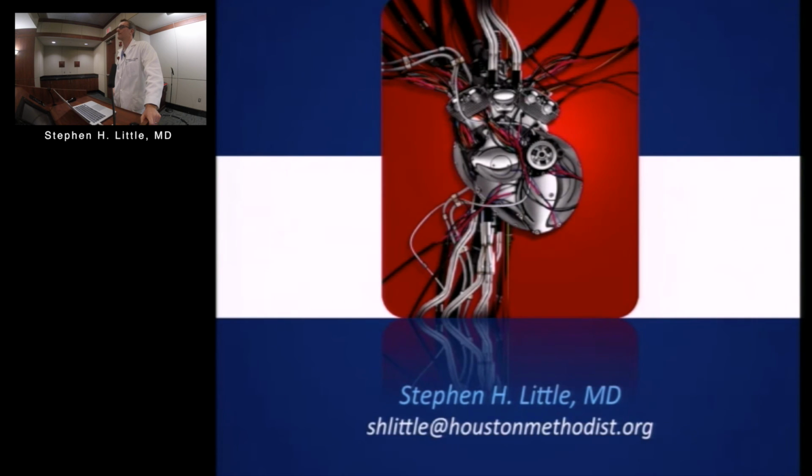Is there any way where you can put information in and model as if you were clipping different areas? So that's a good question, Belinda. That's kind of what we're trying to get to. We're just signing a contract with Abbott to do in vitro MitraClip modeling. That's basically to see how much of this residual MR is predictable.